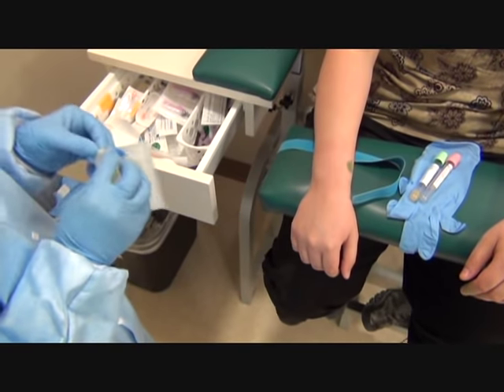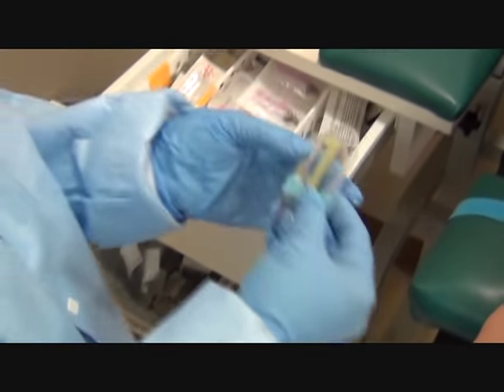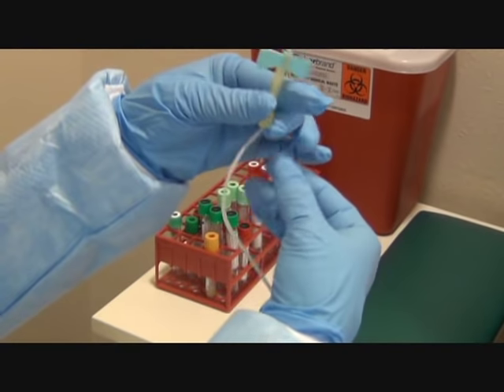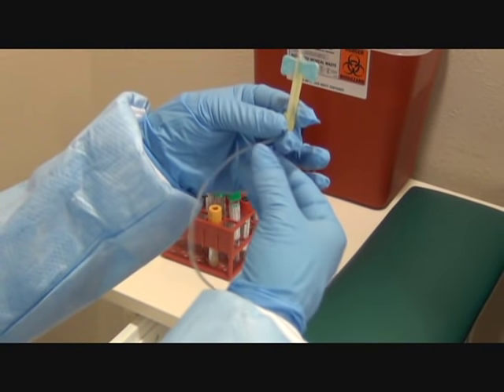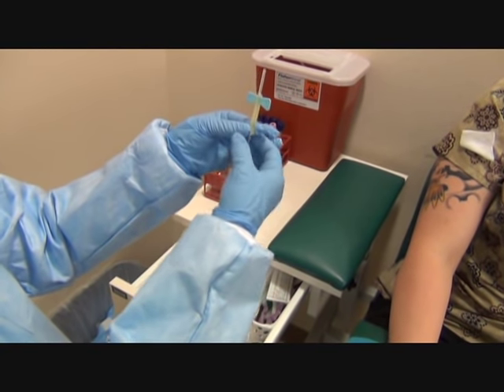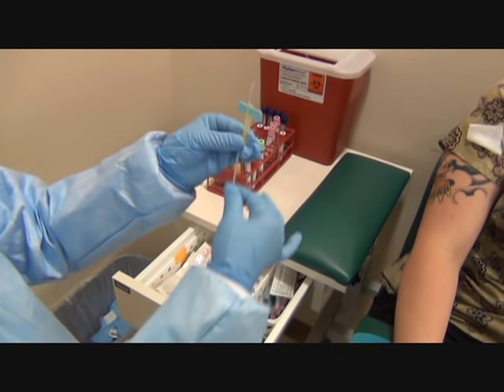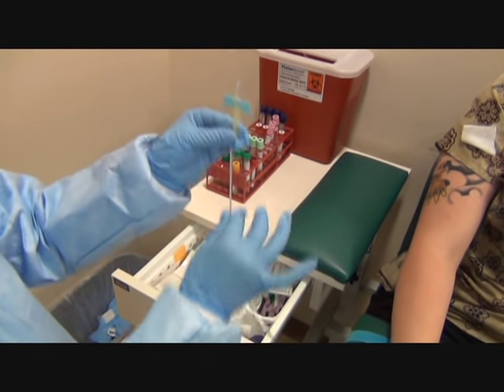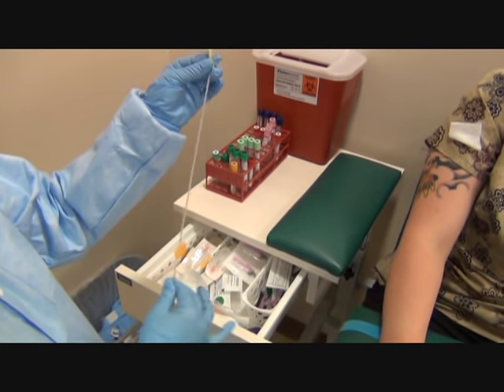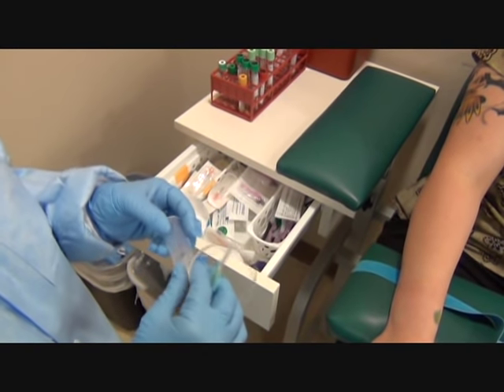I'm going to open up my packaging. This needle is in a plastic cover, so I'm going to remove that. And then I'm going to uncoil my tubing. I want to be careful when I pull on the tubing, because if I pull too hard, it will pull the needle in — because that's the way it's activated. So I'm going to just lightly pull it straight, giving it a couple tugs, that way it can uncoil the tubing. I'm going to use an ETS method, so I'm going to add a hub. You can also use this with a syringe.